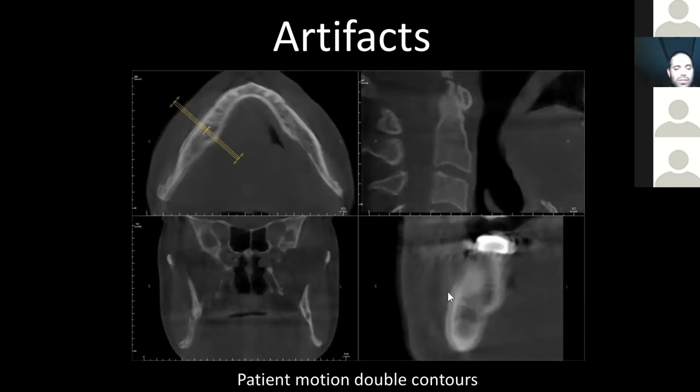And again, if you just need to figure out where an impacted tooth is, or the very rough estimates of alveolar height and width for implant planning, you're done. But if you need to see something small like a missed canal or a suspected fracture or pathology, you're not done. Right? Or even if you're doing guided surgery where you need to get a very nice fit of a guide to that scan later, you're not done. You need to go retake that scan.